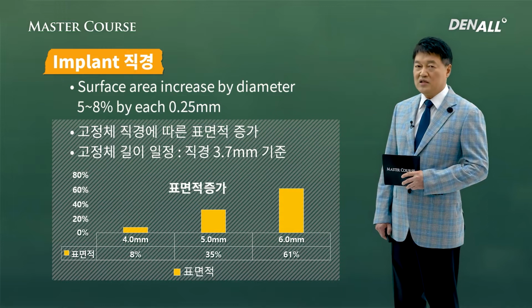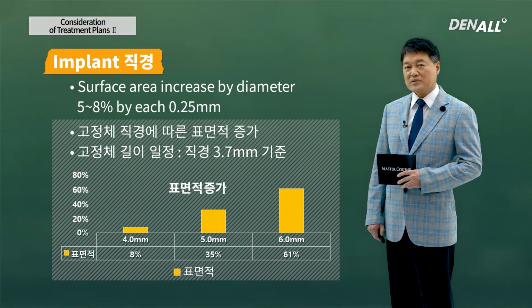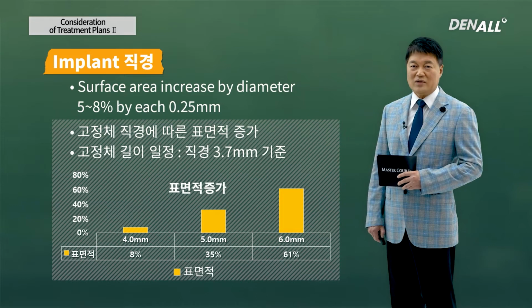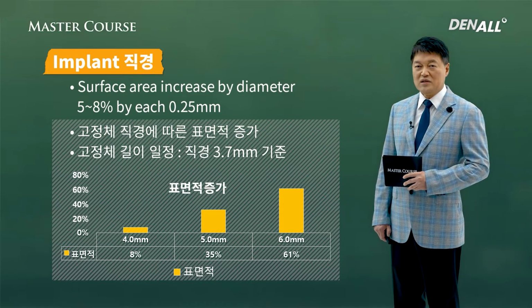With the increase, BIC is improved and implant stability increases, but in patient mouth, there's not enough bony space, so you have to choose adequate size of implant.